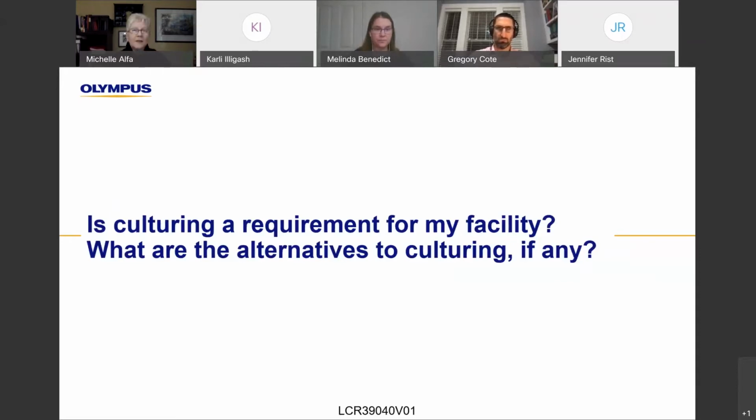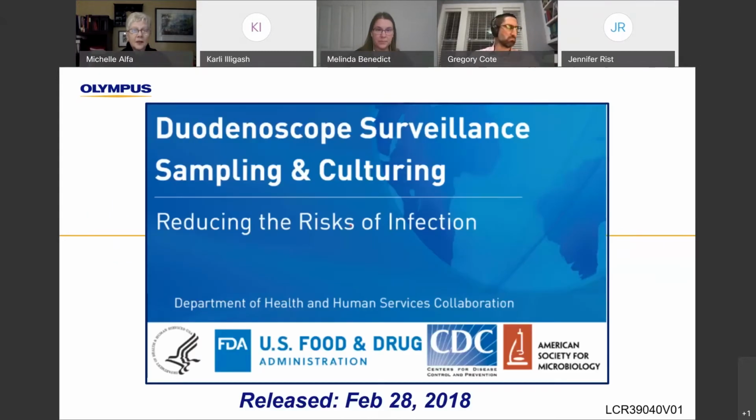Okay, and Mindy, if you can go to the next slide, I just want people to remember that the duodenoscope surveillance sampling and culture protocol that was prepared by the panel and has been approved by the FDA, the CDC, and ASM is actually the only culture method for duodenoscopes that has been validated by the manufacturers and has been shown to provide 65 to 100% extraction efficacy.